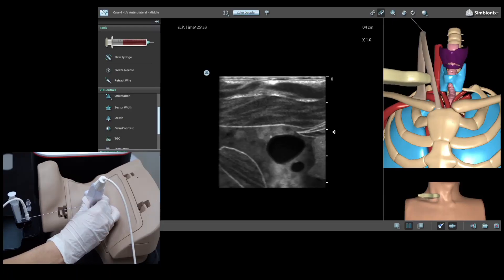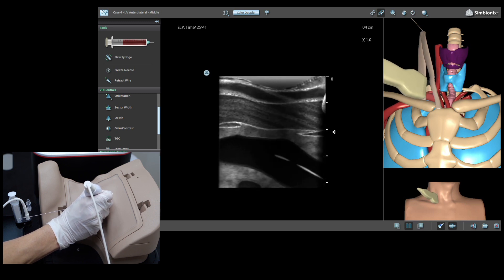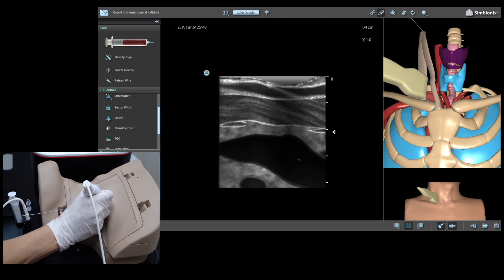Once complete, verify with the ultrasound probe that the wire is in place. Different complications and scenarios are also supported in the central line placement module. During training, performance is tracked and reported at the end of the procedure.